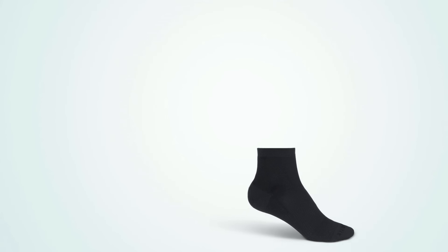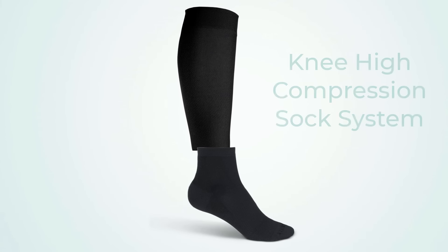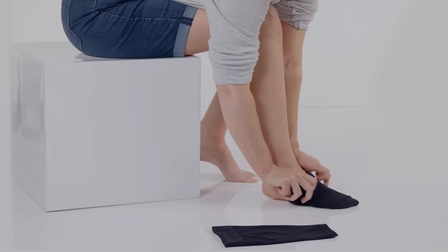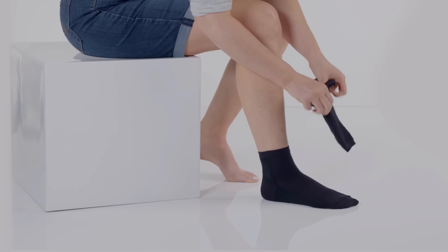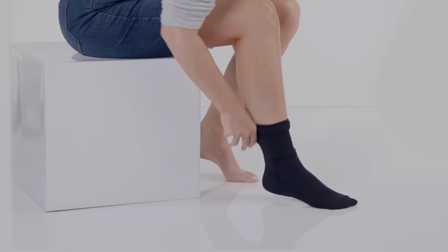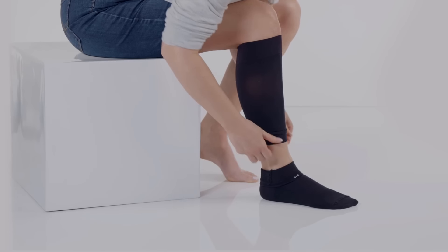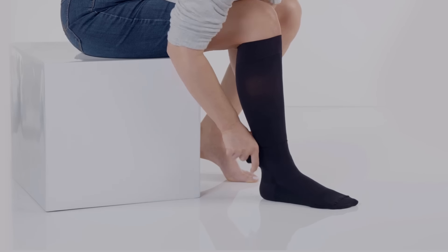The system consists of an ankle sock and a calf sleeve, which together create a knee-high compression sock. To wear the socks, first put on the ankle sock, then slide the sleeve over the ankle sock and pull it up until it covers the calf just under the knee. Pull down the calf sleeve all the way down and then pull the ankle sock up over it.